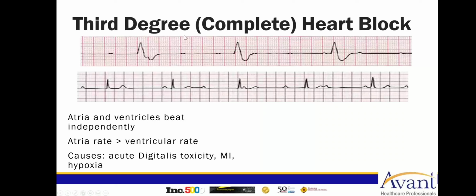If the impulse is coming from the ventricles, is initiated like it is here, then the impulse is going to go away from the camera and you get the wide QRS. This is what we call third degree heart block bundle branch level. Now we're getting to advanced EKG. Don't worry if you don't remember this. This is not something that's going to be on your NCLEX.